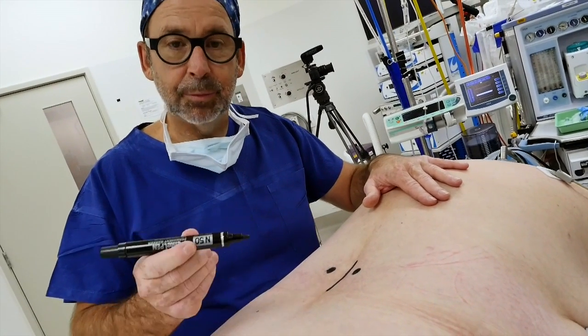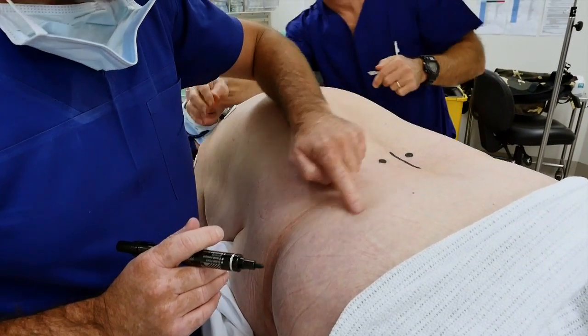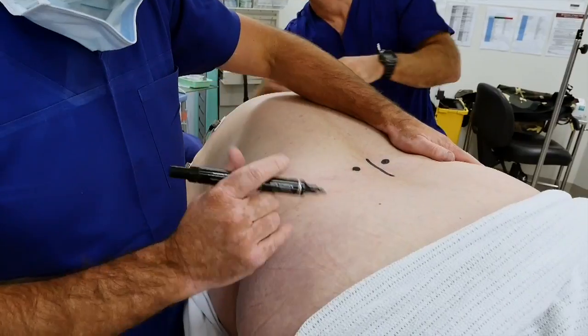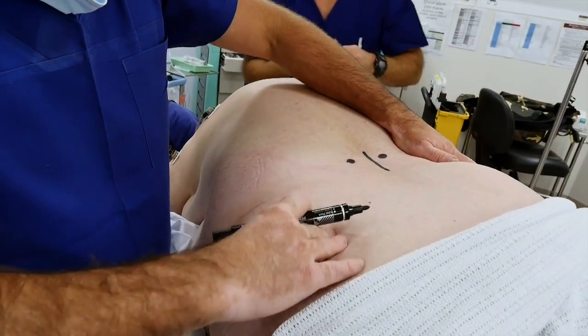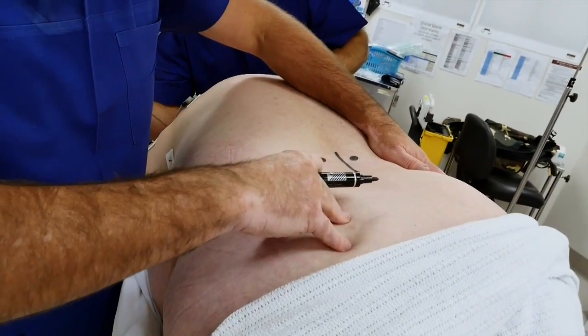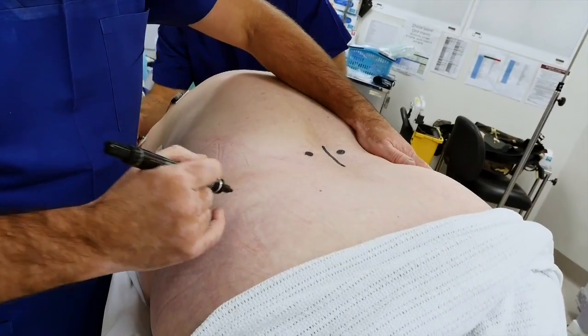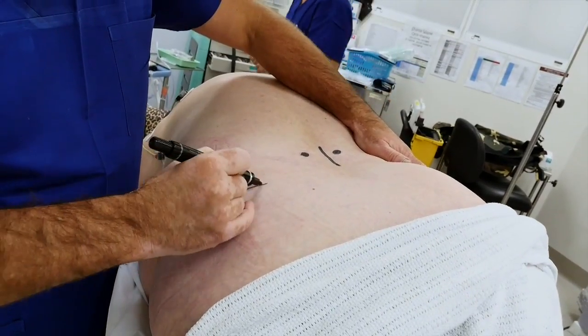I like to just use a permanent marking pen. Below her belt line we're going to create a pocket just in this upper outer buttock here. I think often people in the past have put them too medial and too low, so they've been uncomfortable. Out here in this little fatty pocket we can achieve a nice position.